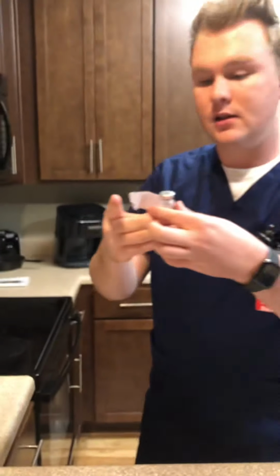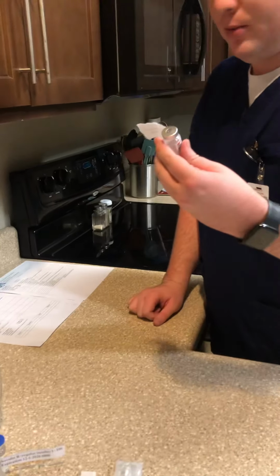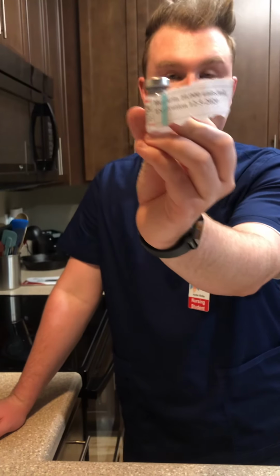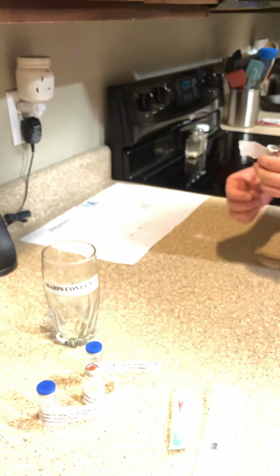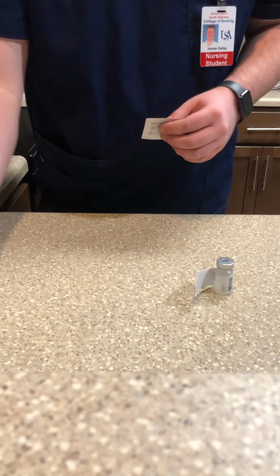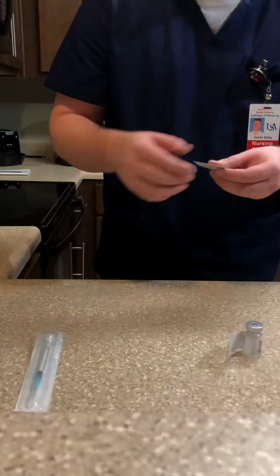Now I'm going to verify this to the MAR. The drug is heparin, and I have heparin. The order is for 5,000 units, and since I have 10,000 units per milliliter, I'm going to have to calculate this. This means I would be giving half a milliliter, subcutaneously every 12 hours to Mr. Jaguar J. Jones. What I want to do now is get my alcohol pad, my TB syringe, because it's a subcutaneous injection, and my blunt tip cannula.